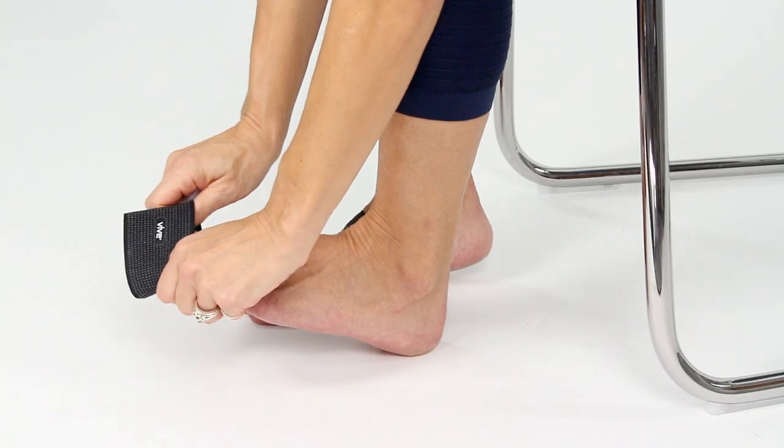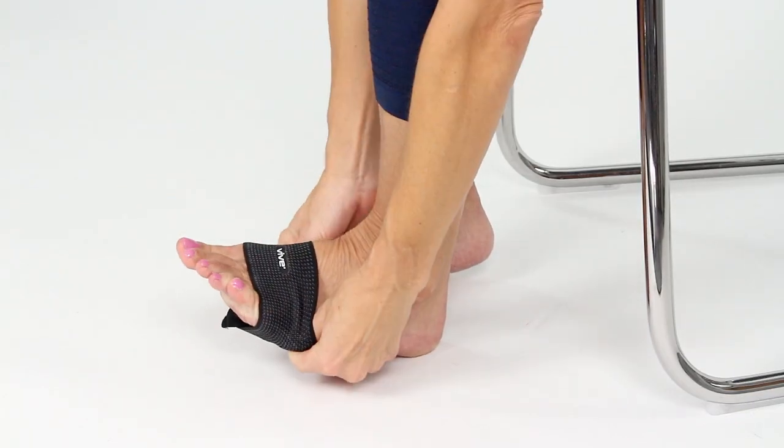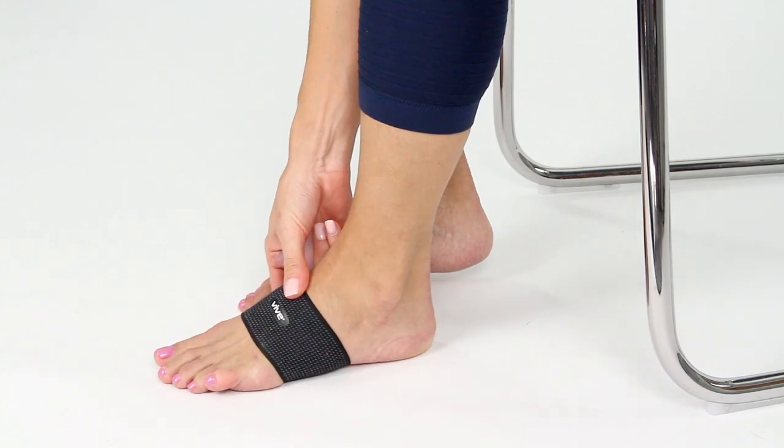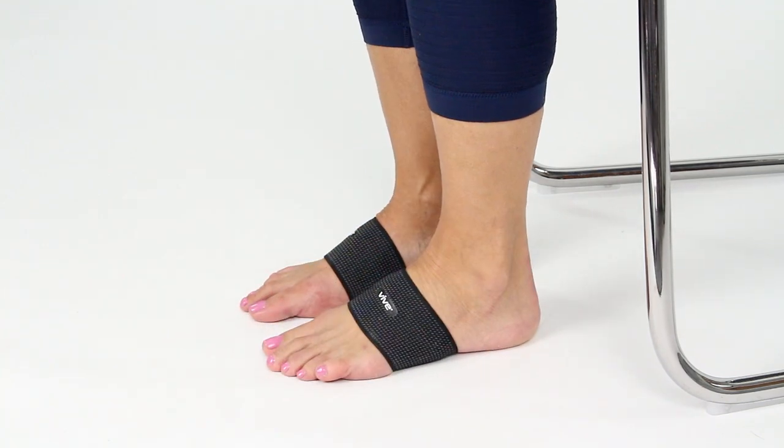Simply slide the gel sleeve onto the foot, placing the gel pack in the arch. You can then put on your shoes that you would wear. We recommend that you wear the gel sleeve during normal activity to provide support and comfort to the foot.